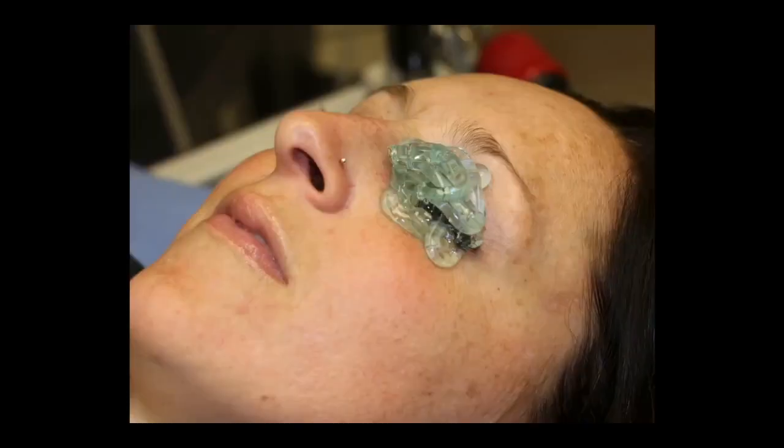As always, you should be scanning on the patient's right. Before you start, you want to make sure you get a good amount of gel on the patient's eye. You want to make sure their eyelid is closed, of course, but you could also be using a Tegaderm underneath this gel here.